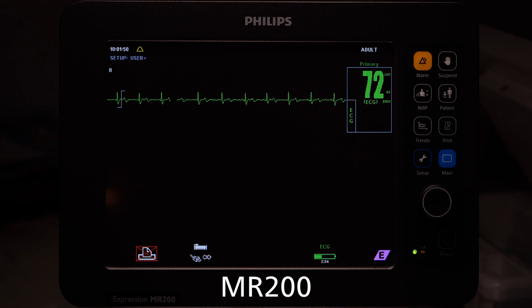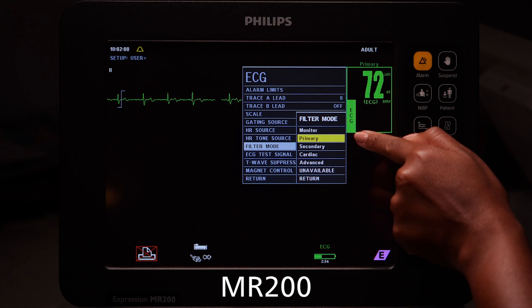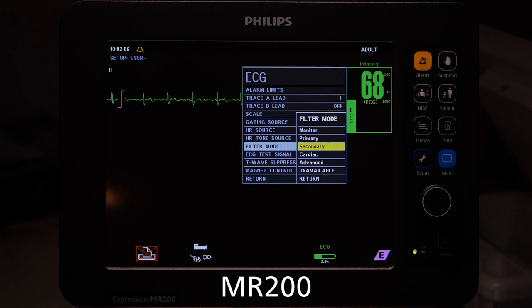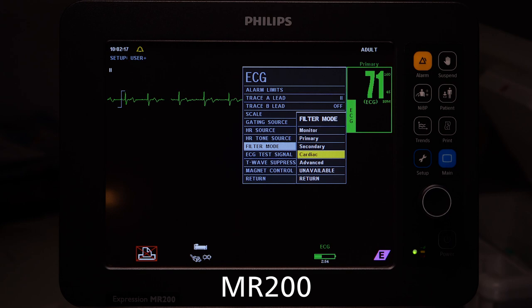For the MR200, there are 5 filter modes available. Primary filter is the monitor's default filter and provides the best possible performance during echo-train type MRI sequences. Secondary filter provides the best possible performance on most non-cardiovascular MRI sequences. Cardiac filter provides the best possible performance during cardiovascular MRI procedures that involve steady-state free precession imaging with balanced gradient sequences on 1.5 and 3.0T MR systems.